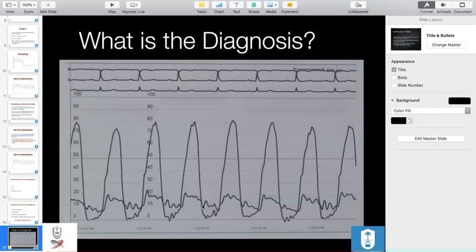Do you think it's downsloping, upsloping, or horizontal here? You really can't tell, but here it starts to clear out. So it looks downsloping here, more clearly over here, over here, over here. Okay, so let's assume this is the case. So this is a downsloping.